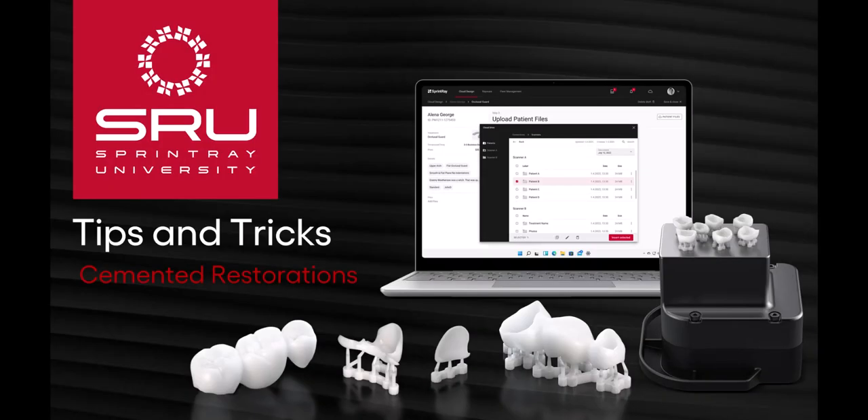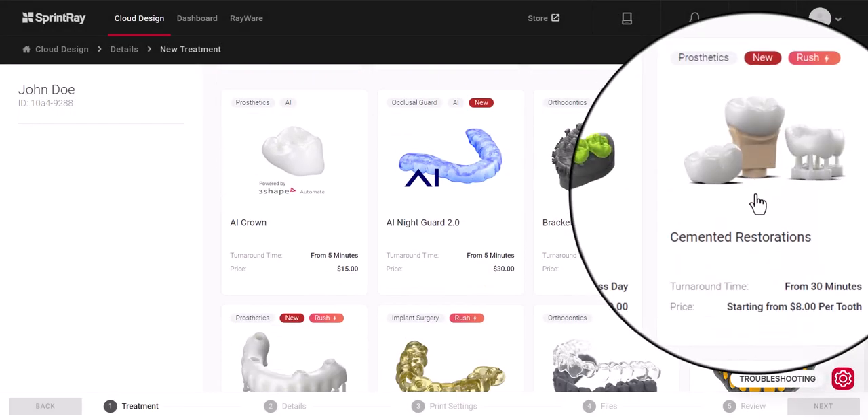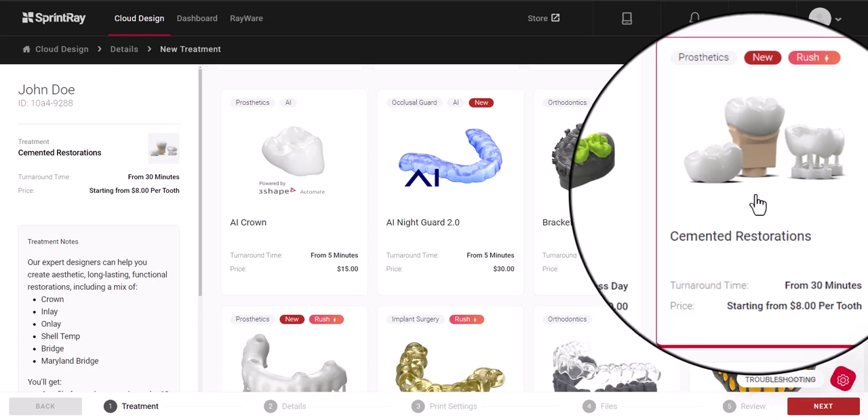SprintRay has gathered all of our cemented restoration designs into a single form, so now you can mix and match as needed. If you need an inlay, onlay, bridge, or design for an anterior tooth, select cemented restorations.